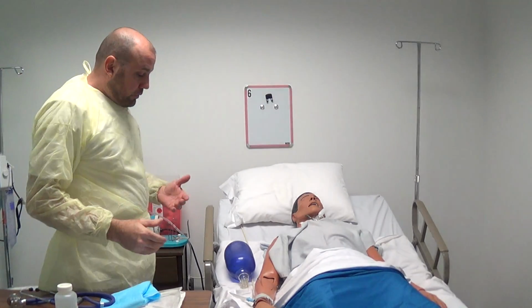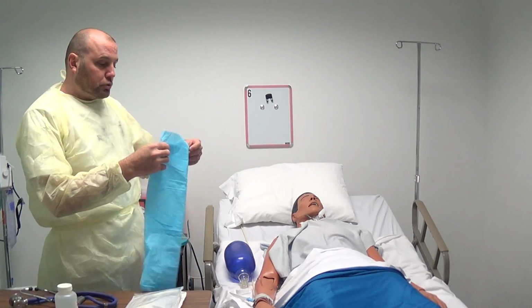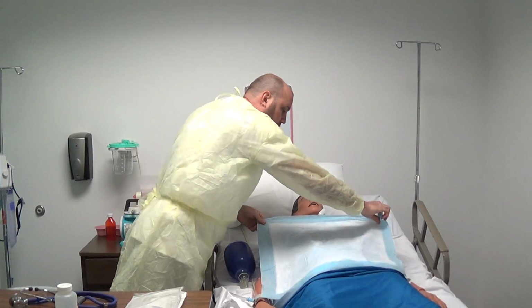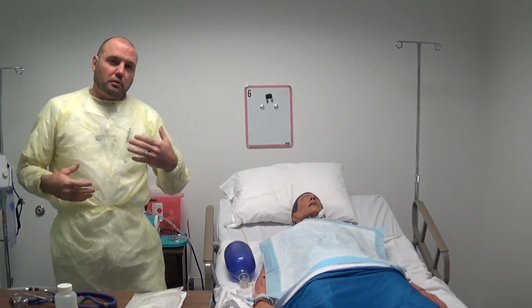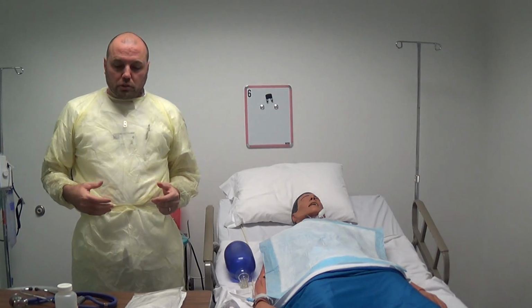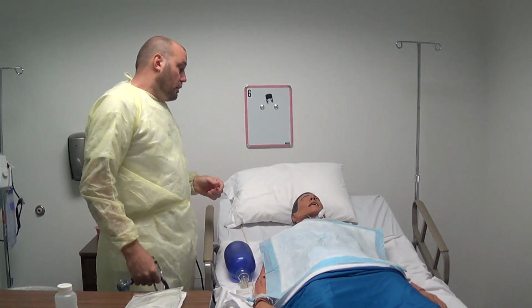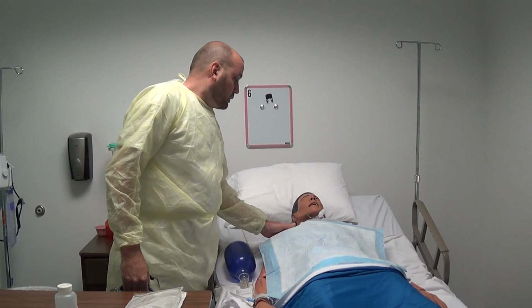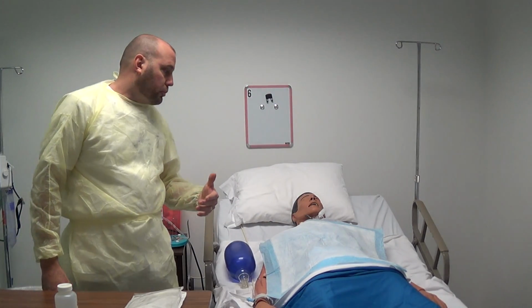So, in this procedure, I'm going to use a drape over the patient's clothes to protect his clothing from any possible secretions. And although I have my PPE on, I'm not going to wear, for the purpose of this video, the mask or the face shield myself. I want to establish a distress signal, and in explaining the procedure to the patient, he indicates that he has had this done frequently and he is familiar with the procedure.